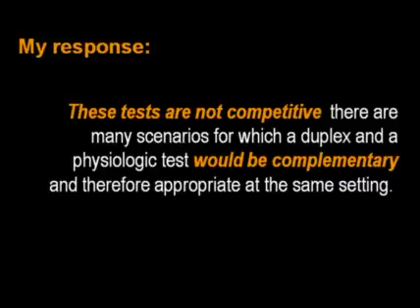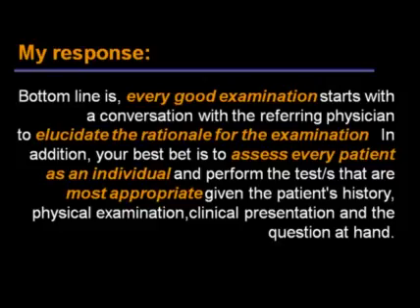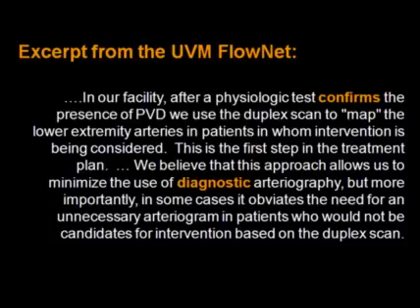There are many scenarios for which a duplex and a physiologic test would be complementary and therefore appropriate at the same setting. And the bottom line really in these patients is that every good examination starts with a conversation with the referring physician to elucidate the rationale for the examination. In addition, your best bet is to assess every patient as an individual and perform the test or tests that are most appropriate given the patient's history, the physical examination, the clinical presentation, and the question at hand.